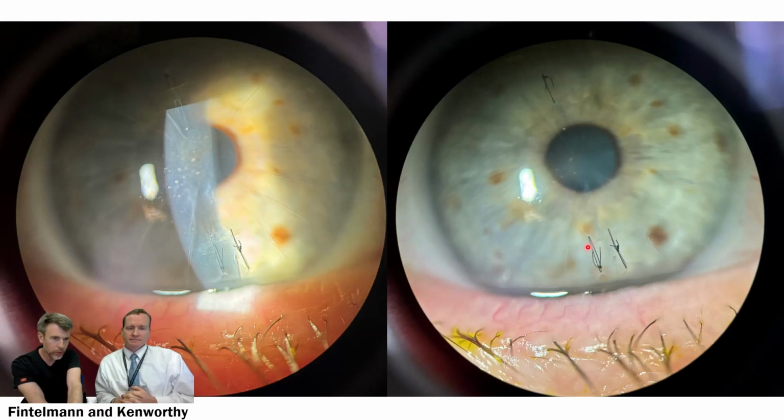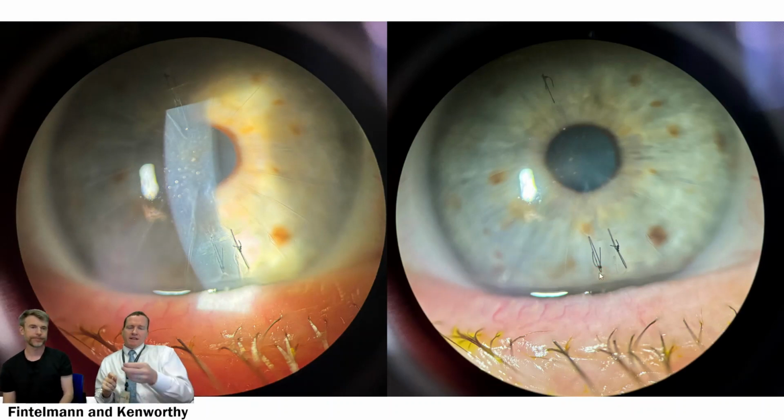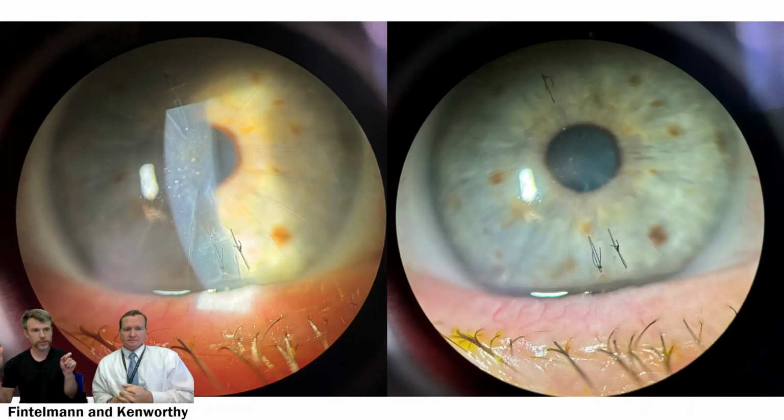So if I were to remove this, I would cut it here and then pull in this direction. That way the suture rotates out in the area of least resistance. Is it also a way to make the actual knot pass through the least amount of tissue, if it's coming out that direction? Correct. So I try to place it on one side of the wound. As you can see, I rotate it in, and then taking it out, I try to limit the amount of tissue it has to travel through, so it's less likely to break.